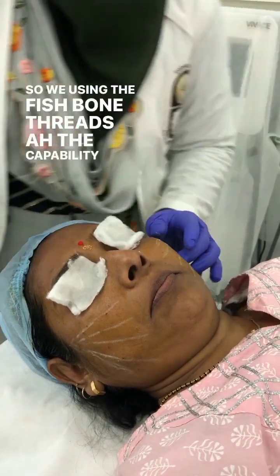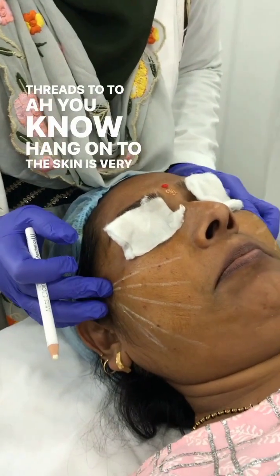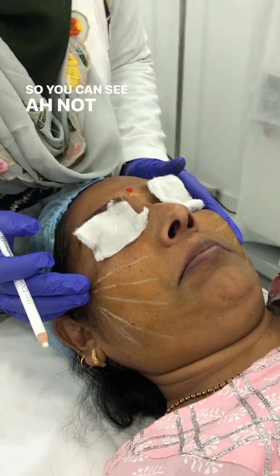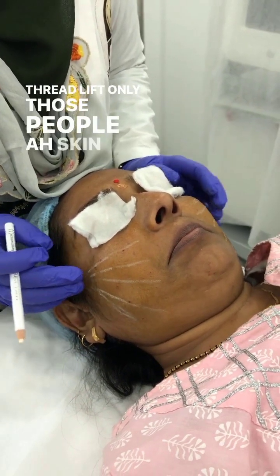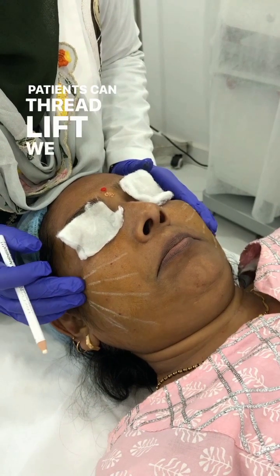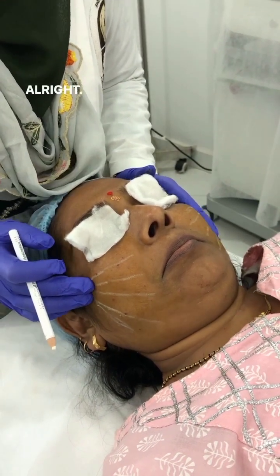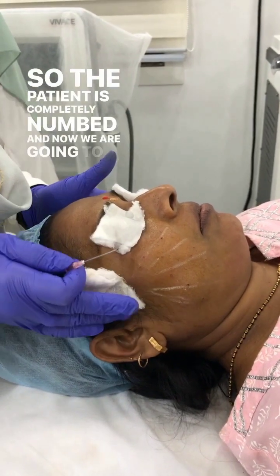The capability of the threads to hang on to the skin is very strong, and that's why we'll be getting better results. Not every patient is an ideal candidate for thread lift. Only those people where, if we lift the skin like this, we can see at least 0.5 centimeter of lift, can we do a thread lift. So we can see evident lifting of the skin. The patient is completely numbed, and now we're going to start the treatment.